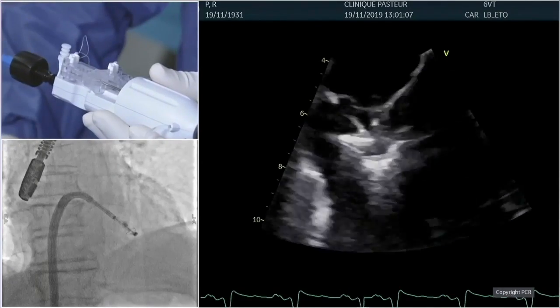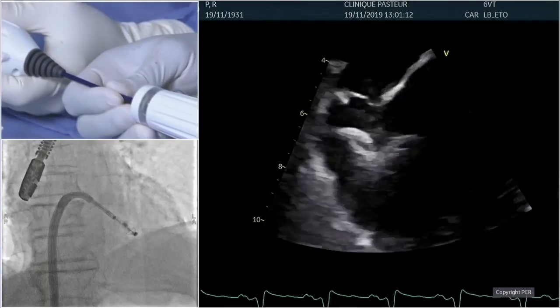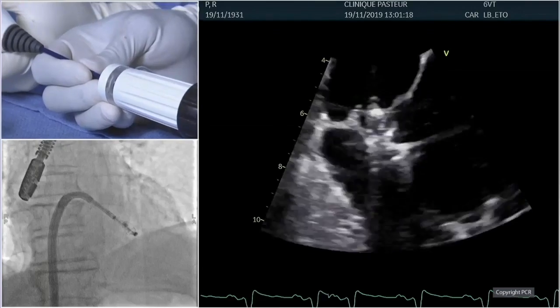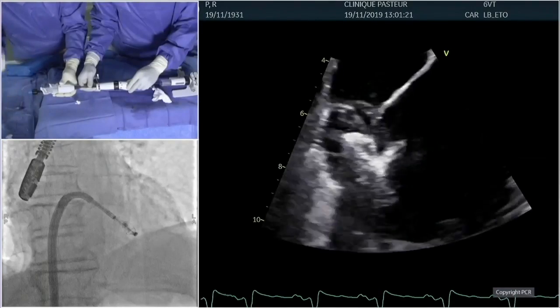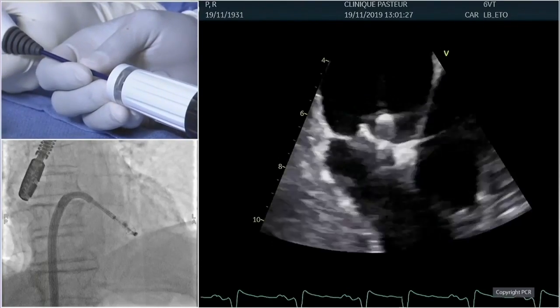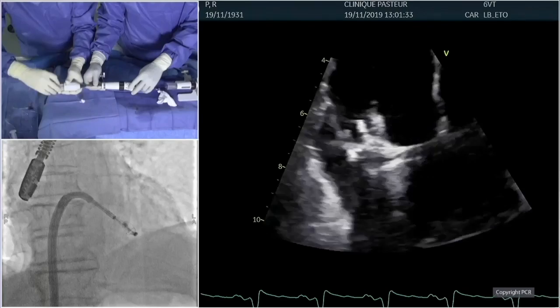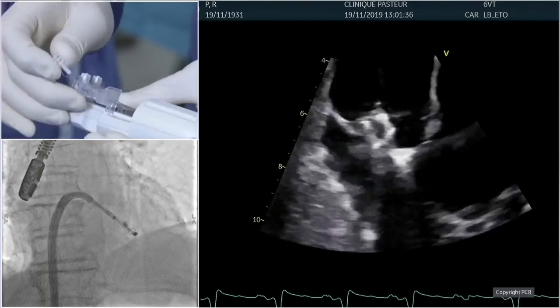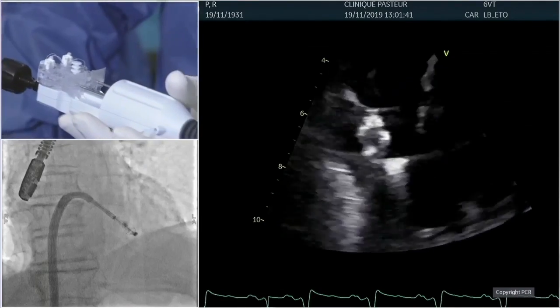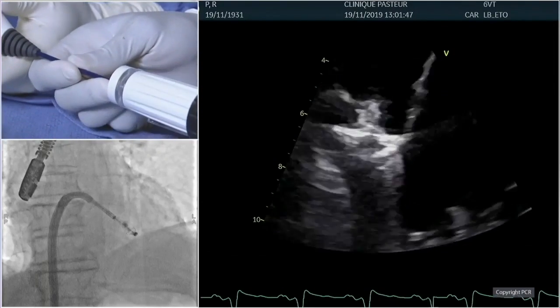But you see that I'm not sure that we are not above the clasps. We perfectly see the bouncing of the anterior one. But for the posterior, I think we're a little bit above. Yeah, it's above. So what we could do is just raise the two clasps and go for another attempt. Okay, let's do it. So we have to synchronize them. We can raise the two. And then we are going to correct, maybe focusing more on the posterior first. Okay, posterior is in. I'm going to correct for the anterior.